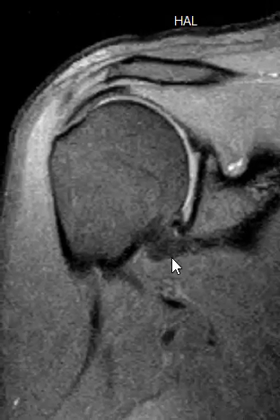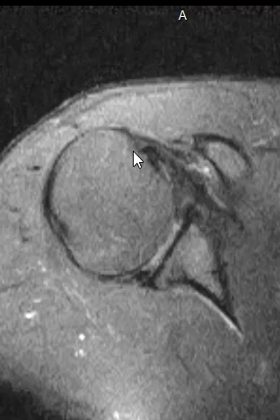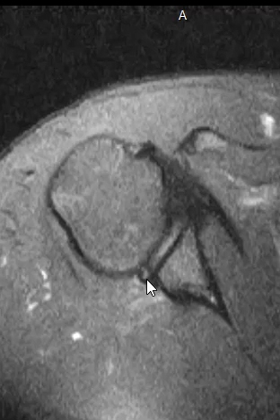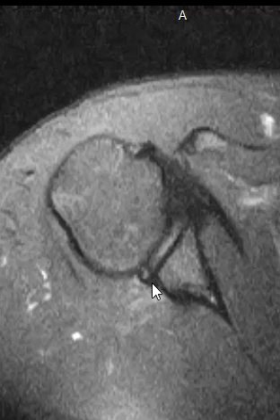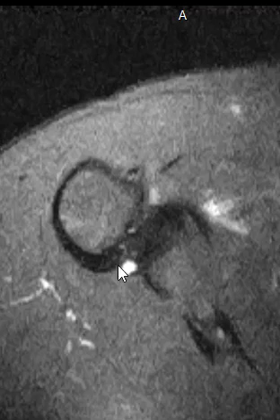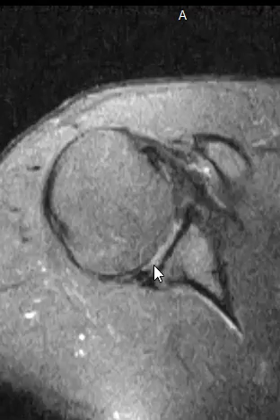This is the main finding: a tear of your posterior inferior labrum. From another orientation — there's a little bit of motion so it's slightly blurry — but this is the humeral head sitting in this cup, and this is part of the labrum, that little black triangular wedge of cartilage. Going down, you can see the brightness within it as the labral tear, and then a little bit of fluid behind it. This little round ball of fluid is the paralabral cyst. So you have a small labral tear with a paralabral cyst — that's the main finding and probably the source of your pain.